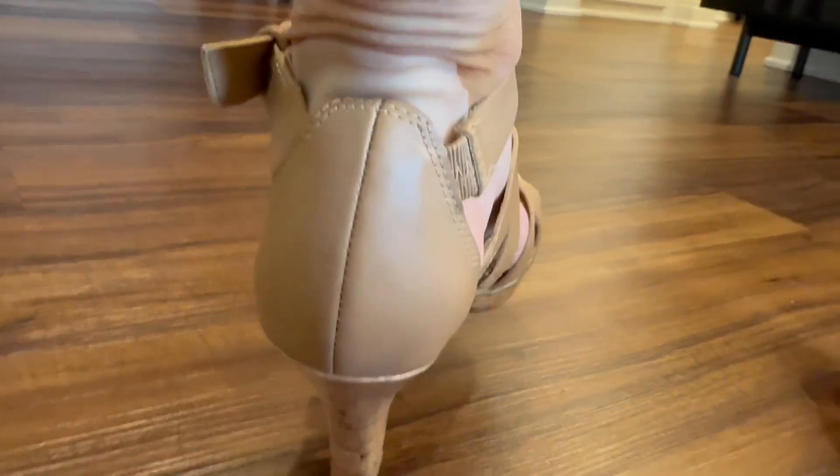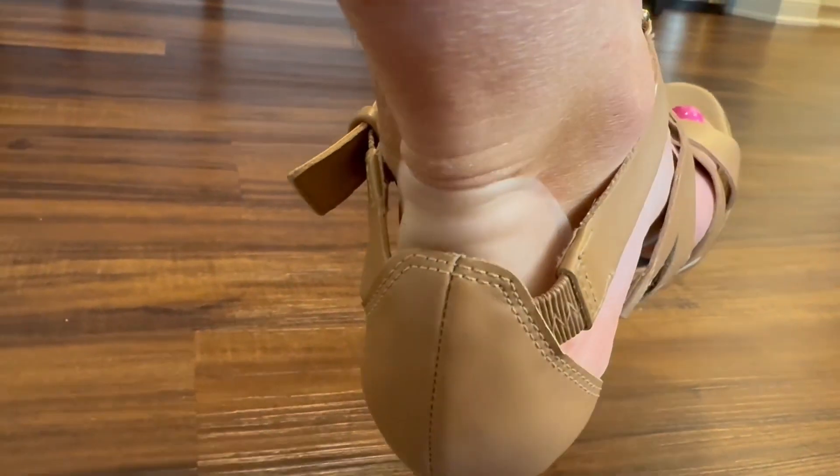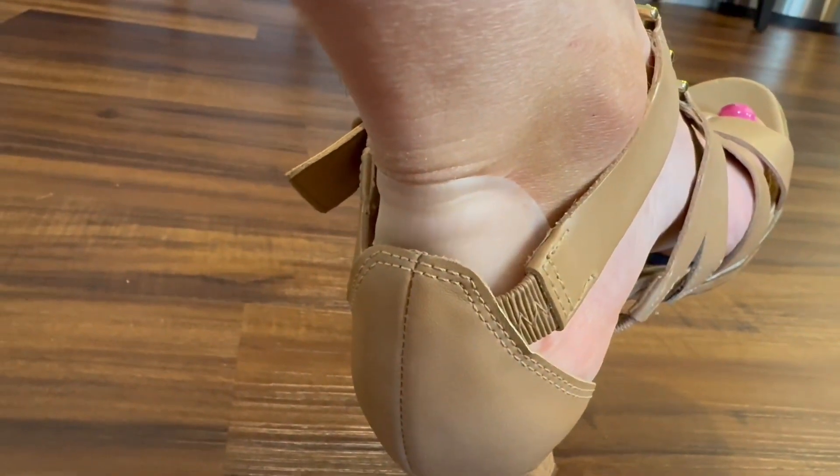My feet tend to get a little bit sweaty, especially when the weather is hot. And even with that perspiration, these bandages do not come off. Even when I shower or go in the jacuzzi, the bandage stays on securely.